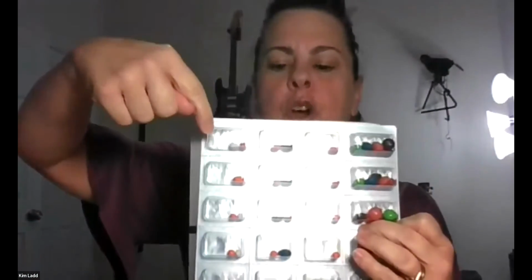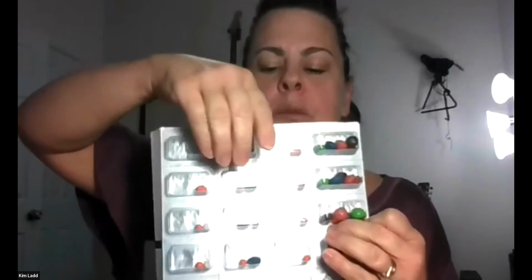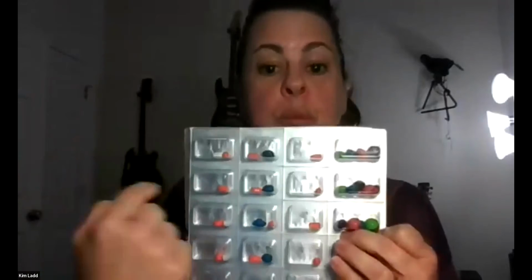This person takes pills 4 times a day. So you're just going to go across like you're reading a line of text. Sunday AM, noon, dinner, and PM, and they have filled your pill box for you essentially. So these are some of the tools that they have aside from the ScriptTalk.